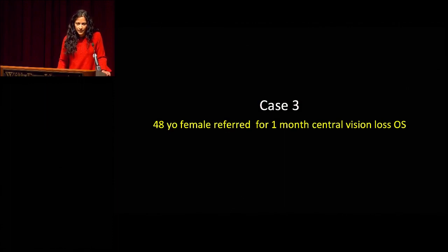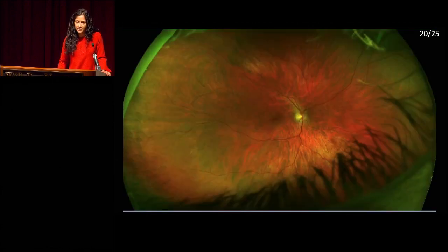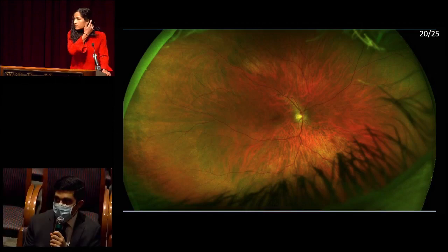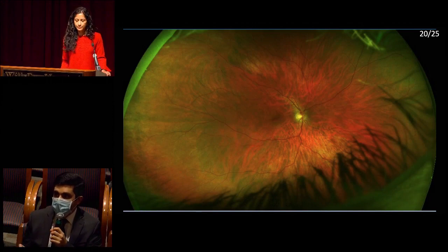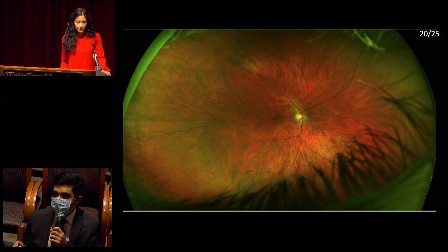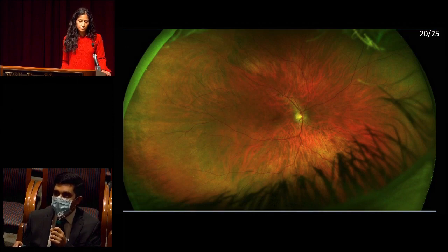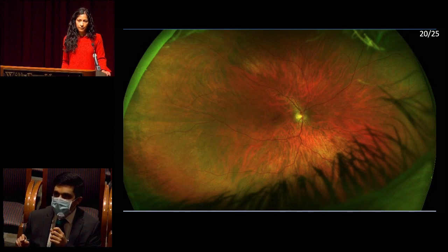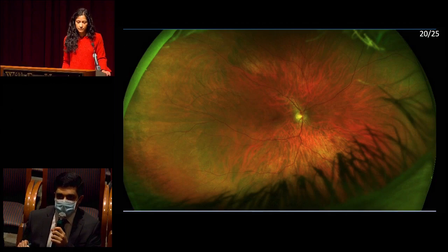Our last case is a 48-year-old female referred for one month of central vision loss in her left eye. Pseudocolor wide-field fundus photo of the right eye shows 20-25 visual acuity, clear media, sharp optic disc margins with a slightly tilted appearance, some peripapillary atrophy temporal crescent, normal vessel course and caliber, a tessellated fundus appearance, and possible peripheral temporal lattice degeneration.